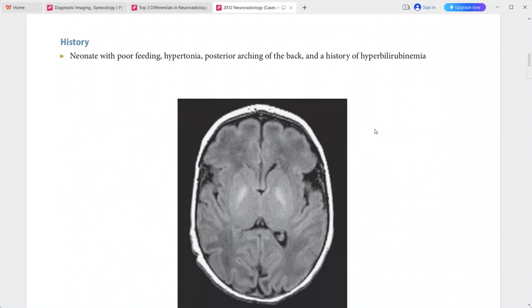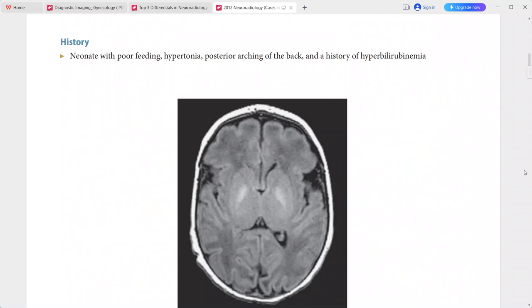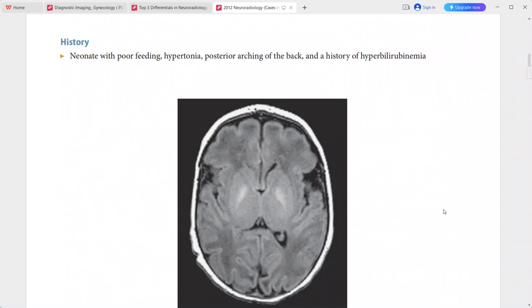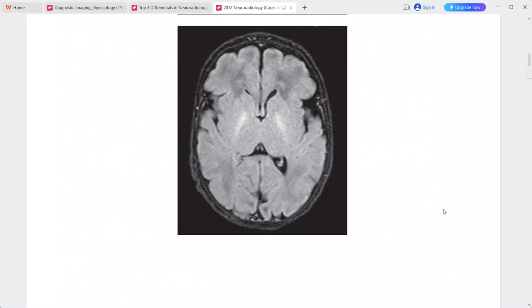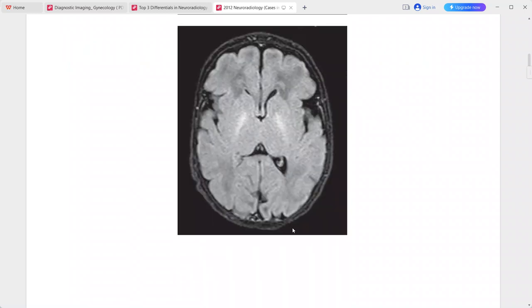Next case: a neonate with poor feeding, hypertonia, posterior arching of the back, and a history of hyperbilirubinemia. Axial T1 and FLAIR images show abnormal symmetric hyperintensity in the bilateral globus pallidi, while the thalami and putamina are normal.